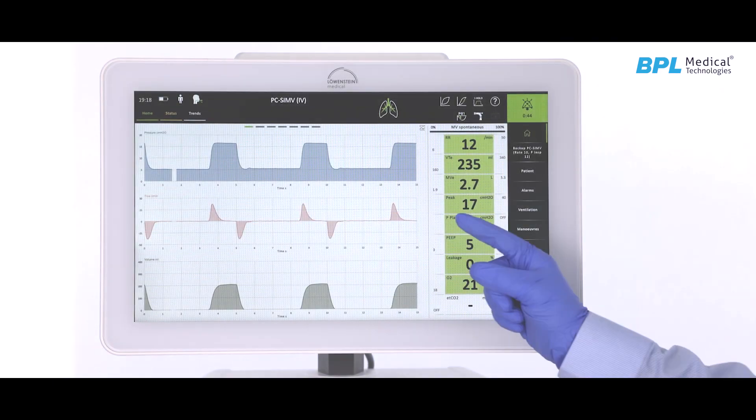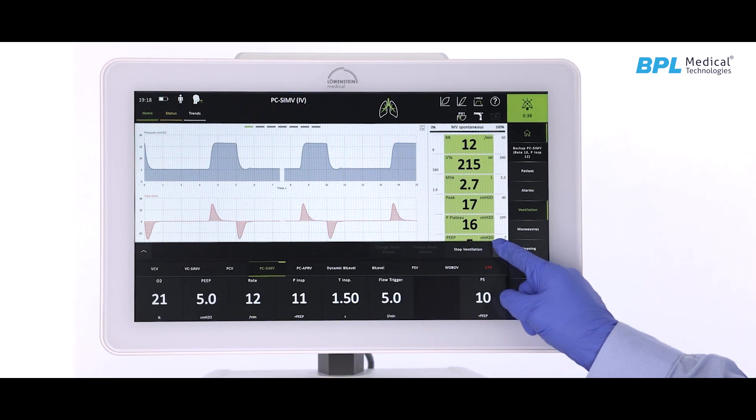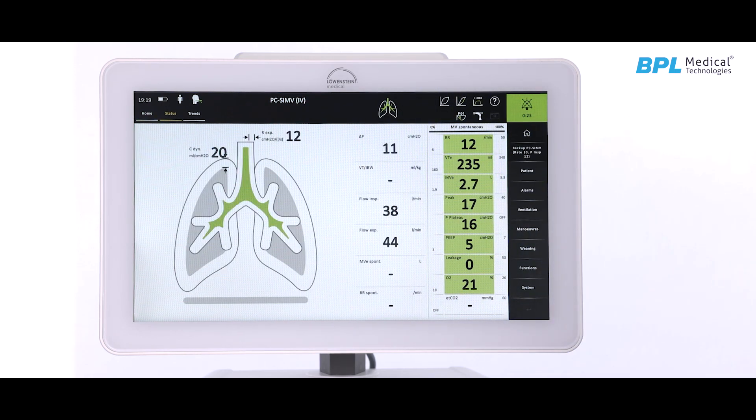The screen is mainly divided into five zones: ventilator control, monitoring of patient numeric parameters, waveforms, alarm message area, and shortcut and dynamic lung counter.